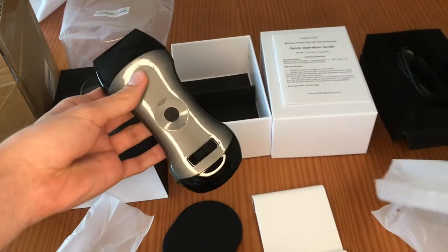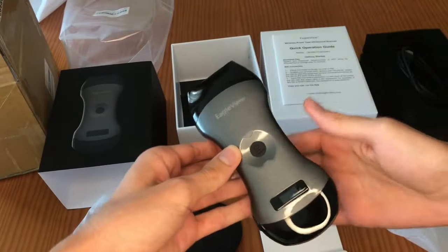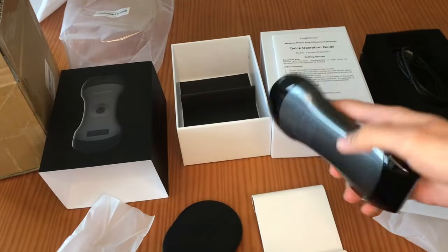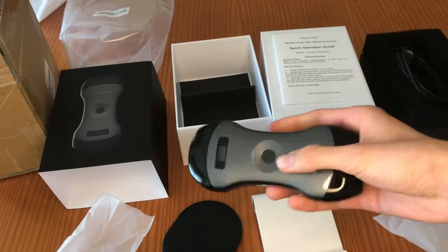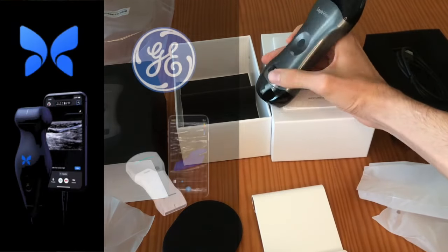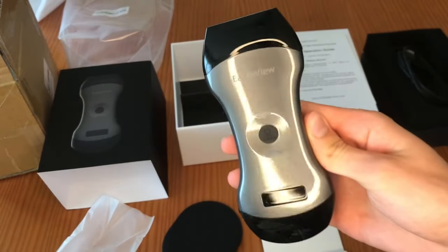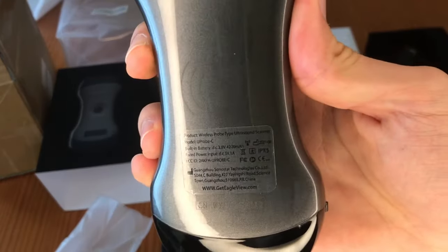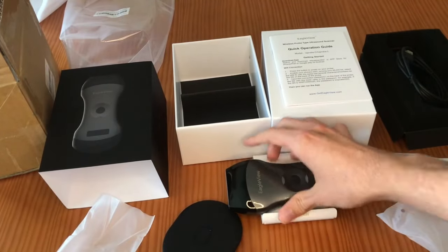It's a wireless dual-head probe that connects to iOS 9 or later and Android 10 or later — smartphones and tablets. Given it's multi-purpose with the ability to scan both very superficial structures with the linear probe and deeper ones with the curved one, I will compare it at the end of the video with the Butterfly IQ Plus and Viscan Air, the two most popular multipurpose devices on the market, since it doesn't make sense to compare with single-purpose probes.